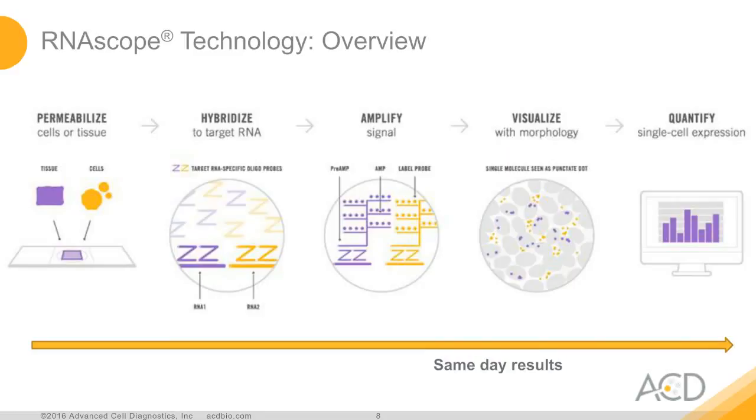And now, here's a brief overview of the RNAscope method. It's a slide-based assay intended for use on the same types of samples you would use for either immunohistochemistry or immunofluorescence, either formalin-fixed, paraffin-embedded, or fresh or fixed frozen tissue sections or cells. The RNAscope methodology involves hybridizing the target-specific oligonucleotide probes to the target RNA. The target probe is a pool of oligos that we've designed using an established informatic algorithm that selects sequences to specifically bind physically to the target sequence and not cross-hybridize with any other sequences, yielding unparalleled specificity.